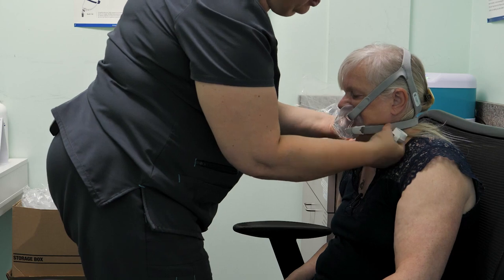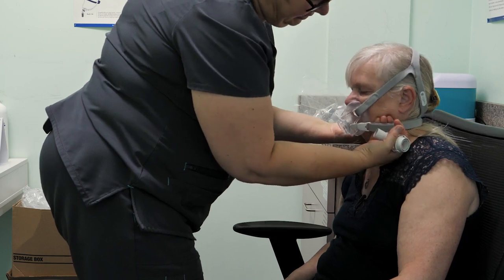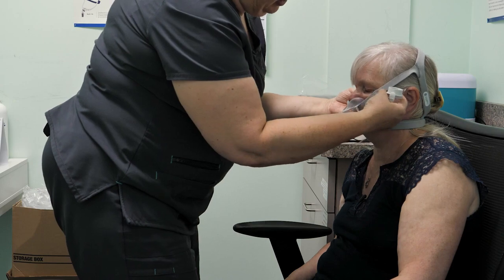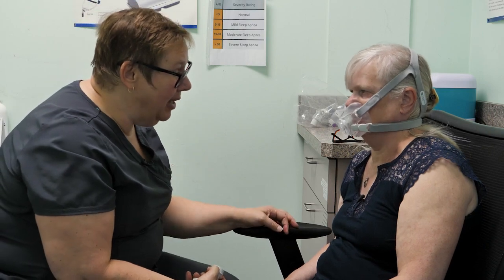When you put a mask on, you should be able to put at least 1 or 2 fingers between the straps and your face, all right? At least 1 or 2. If you can't put any fingers in there, that means it's too tight, and that might result in pressure sores, and we don't want that to happen.